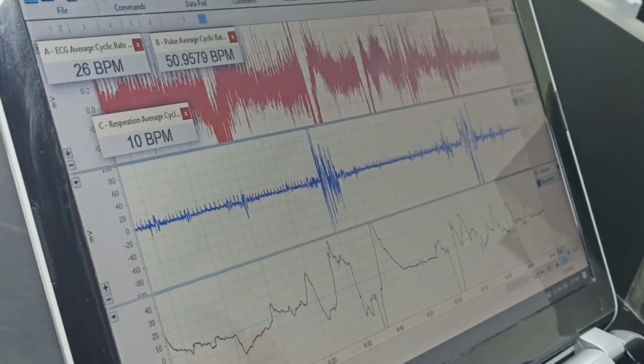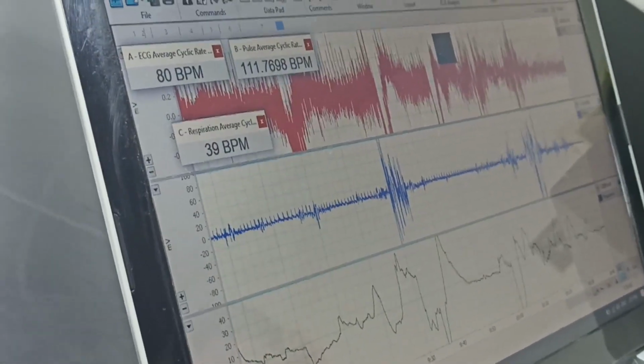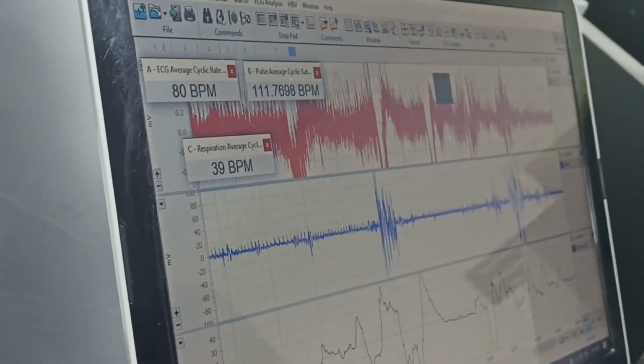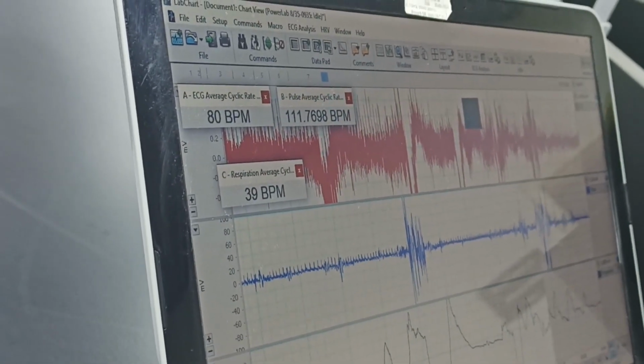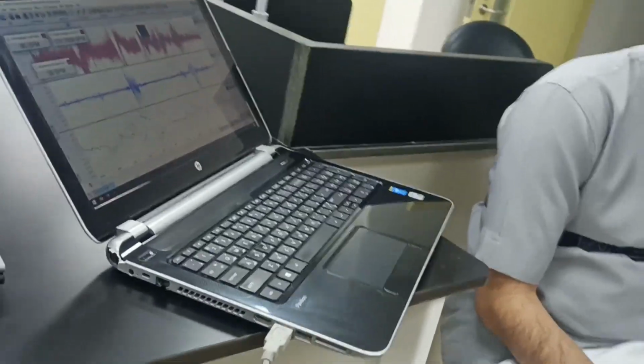These are the areas where the pulse rate really goes high, but because the ECG is also noisy here, we are not looking at it very clearly. Even the blood pressure goes very high for a short period and dips down. So we'll do it inshallah later on again. But I've given you an overall picture and the protocol, then you can release him now. Start taking off the things.